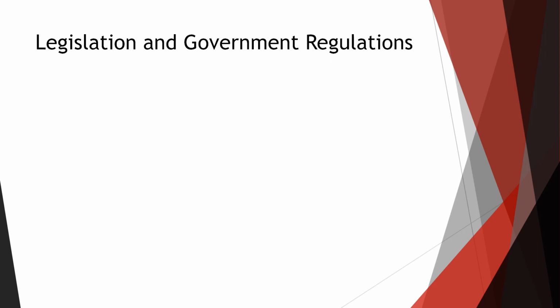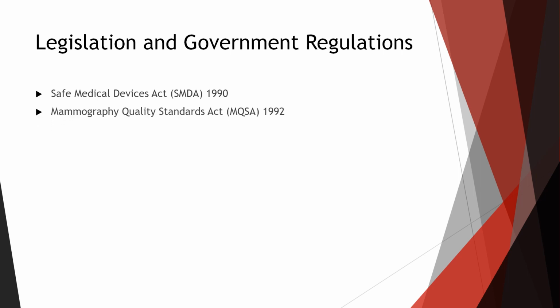So now we'll just go ahead and we'll introduce some legislation and government regulations. There's the Safe Medical Devices Act, the SMDA, which was in 1990, Mammography Quality Standards Act, which was 1992, that was updated by the Mammography Quality Standards Reauthorization Act in 1998.